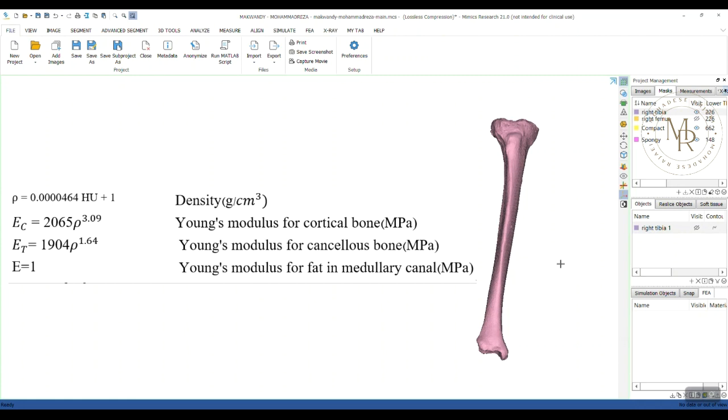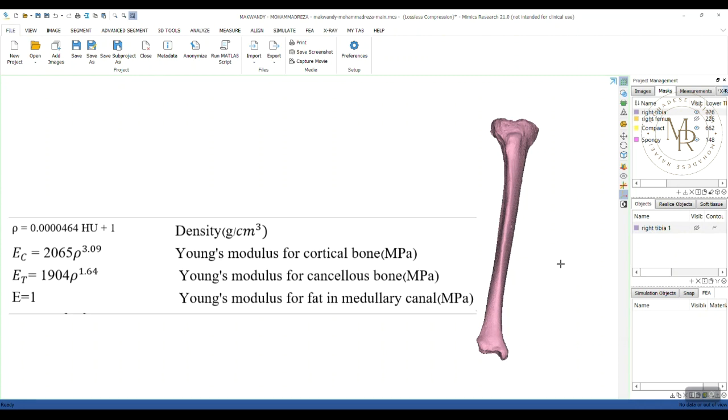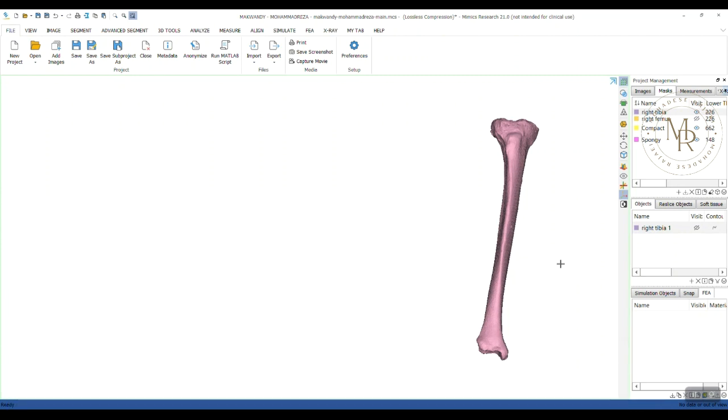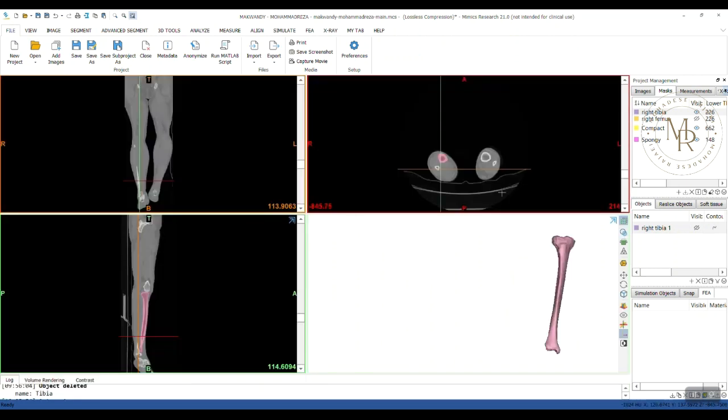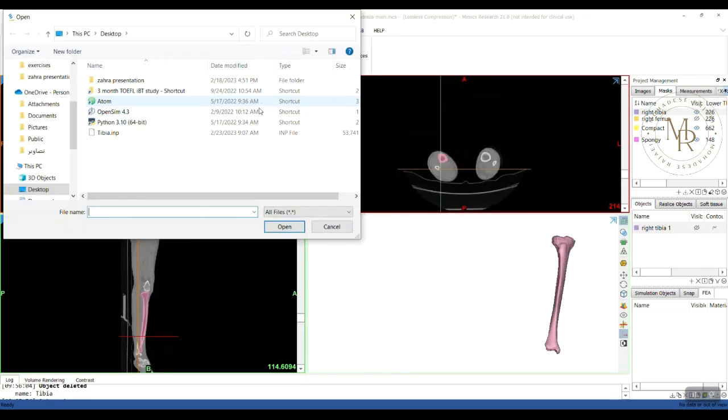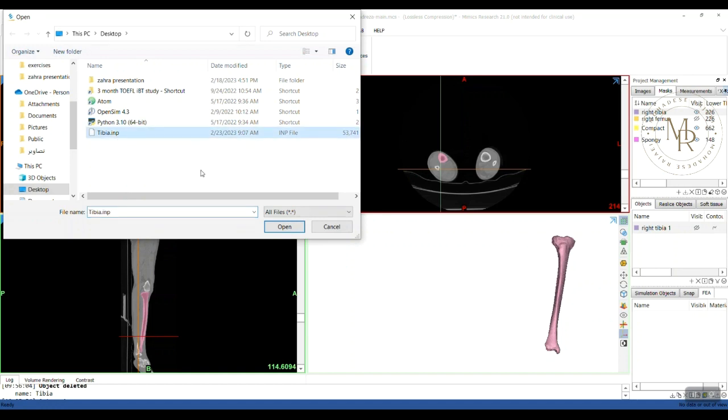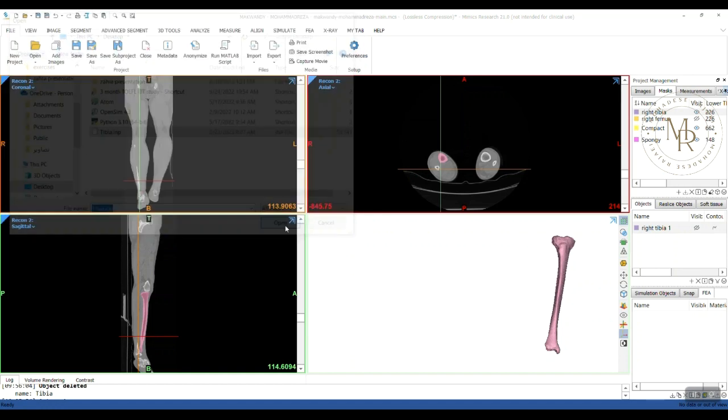Alright, as you've seen in previous videos, we only need volume mesh. So, from here, I import mesh tibia.inp open. I created this INP file before in 3Matic software. So, when you import mesh, you can find it in FEA tab here.